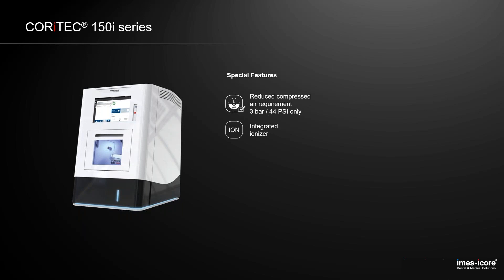The ionizer is integrated for free already. So the machine will be kept clean, free of dust and chips, especially when milling PMMA and other plastics.